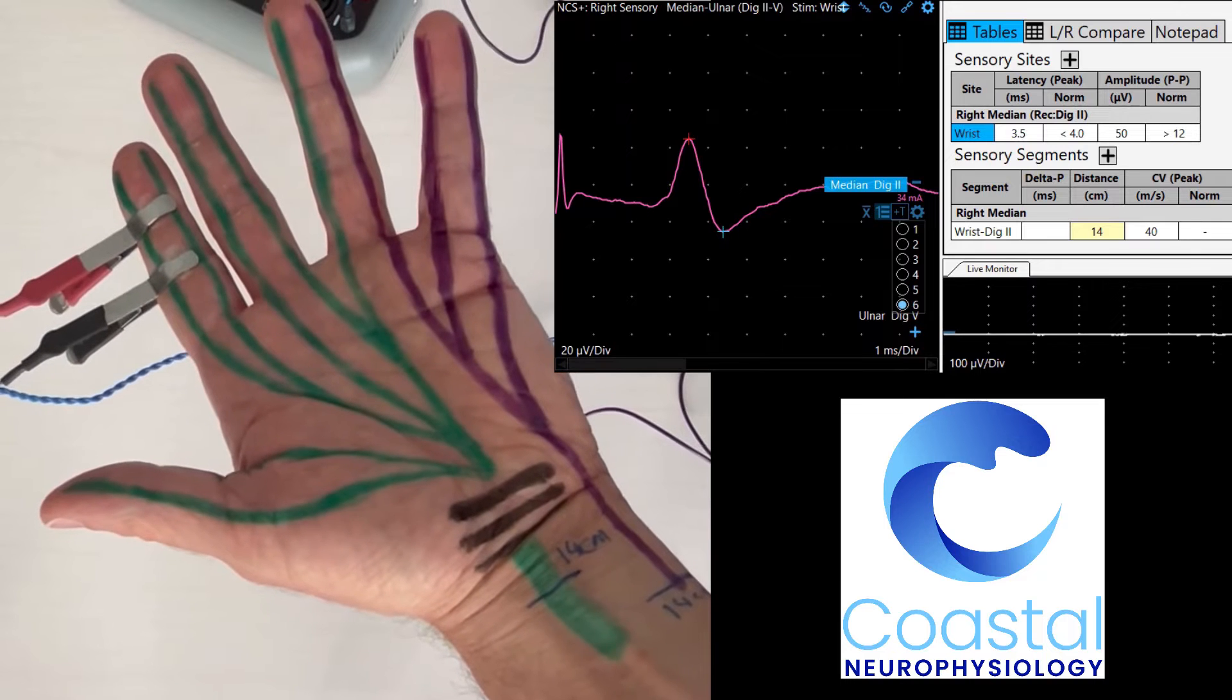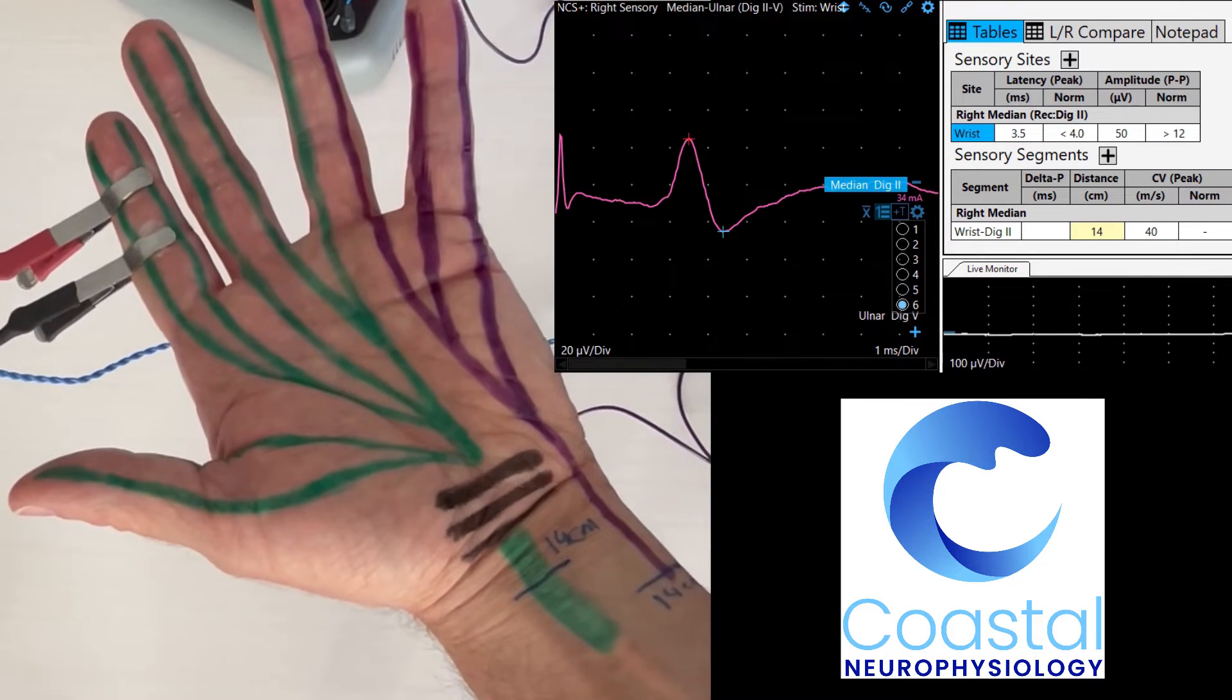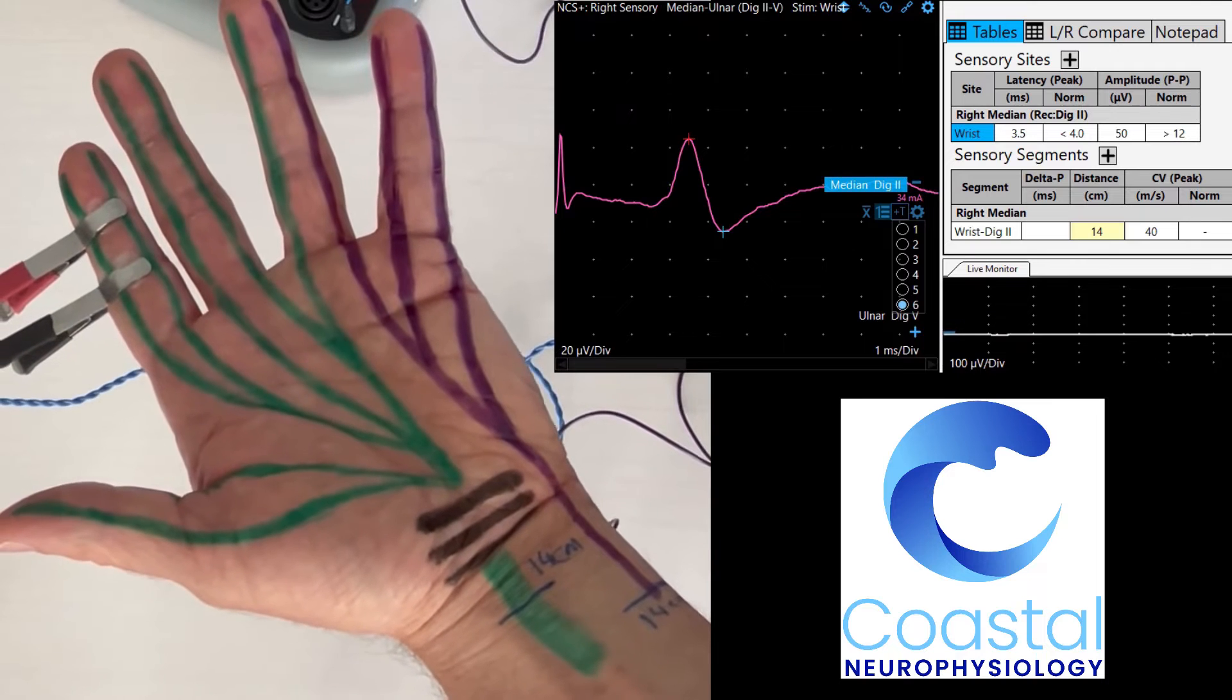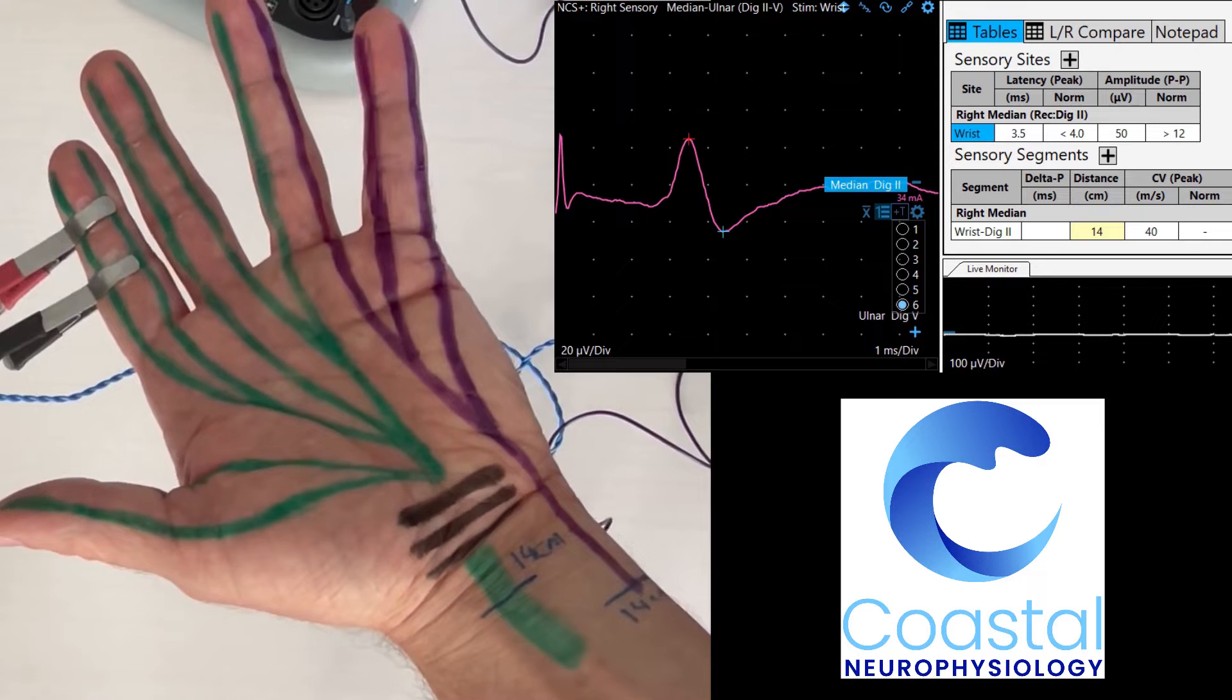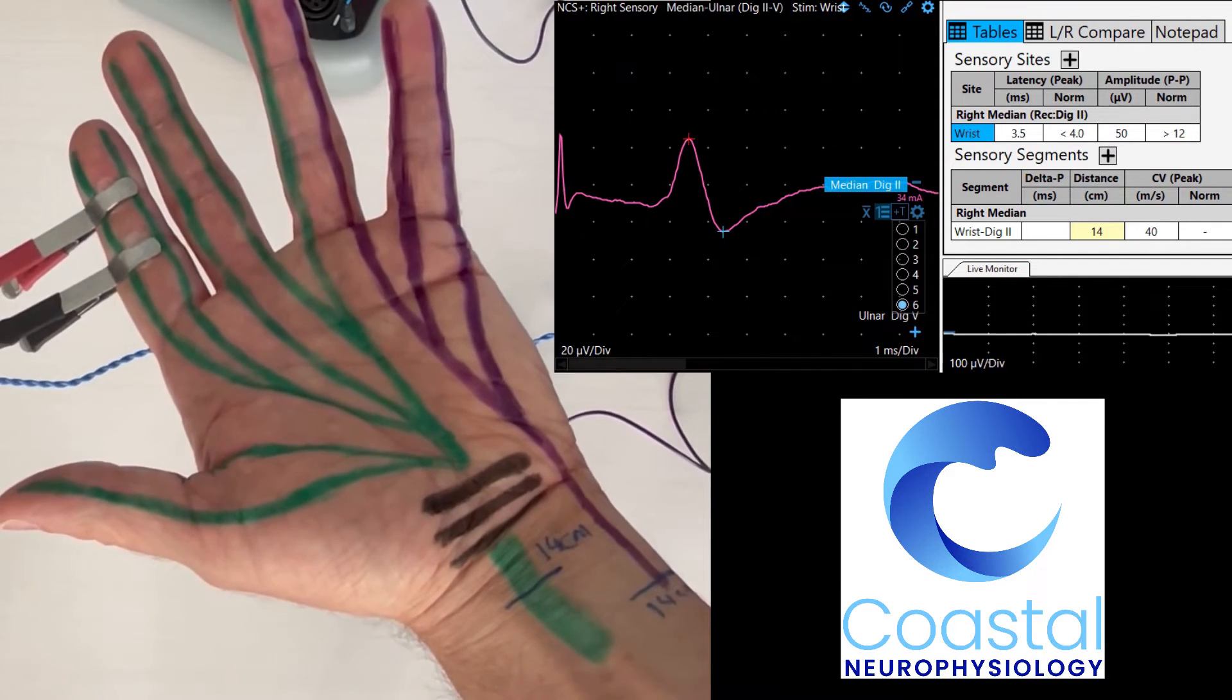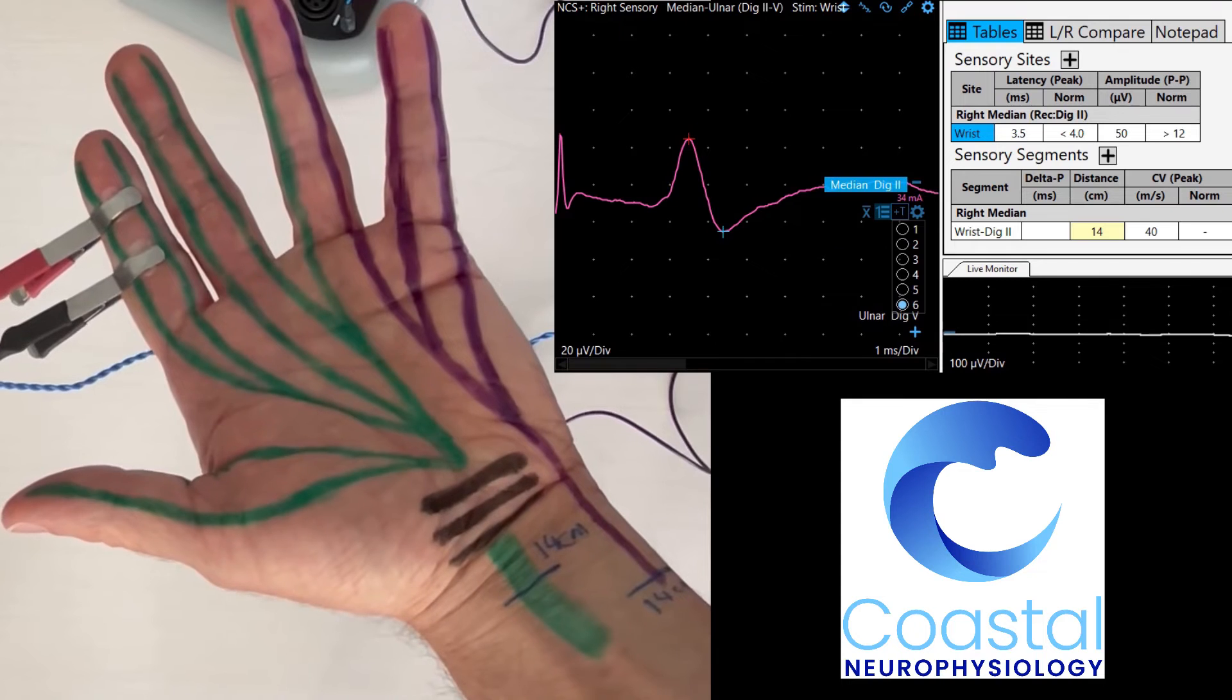There is a marker that you will see on my screen that says latency 3.5. That means it took 3.5 milliseconds for that signal to travel 14 centimeters from my wrist into my index finger. There is also a size of the signal there. It's in microvolts, it is 50. That is a very small signal in the sense that it is a millionth of a volt, a microvolt, but this is 50 microvolts. Anything above 12 in this situation is considered normal.